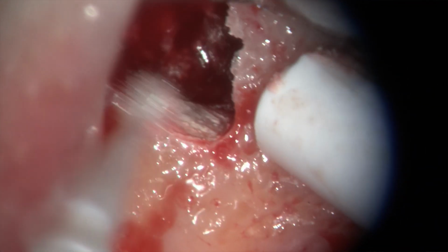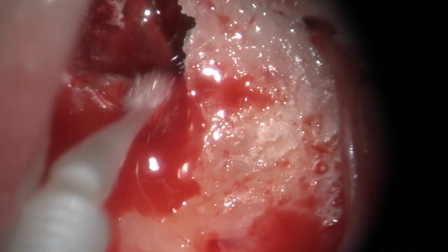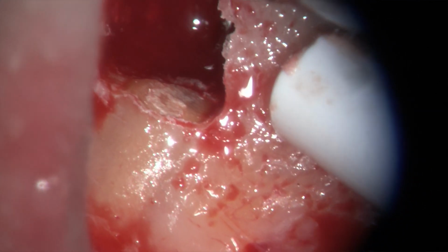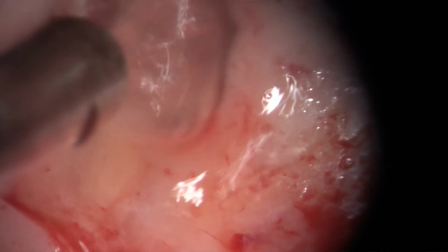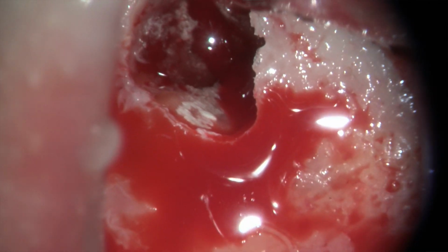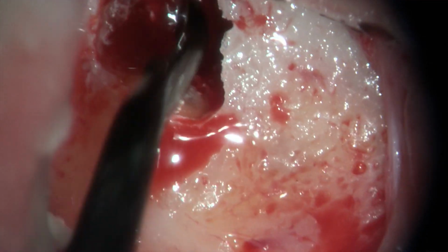Now, this is not quite as involved as doing a retro preparation in each canal and then also preparing the isthmus in between the two. But as you can see, this is a super quick technique. Literally in 5 minutes, you can reflect the flap in this way and curette out the lesion.